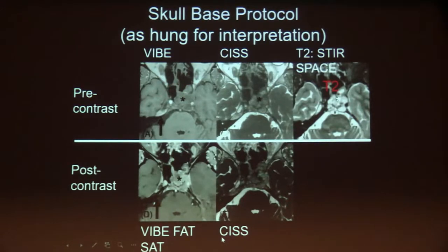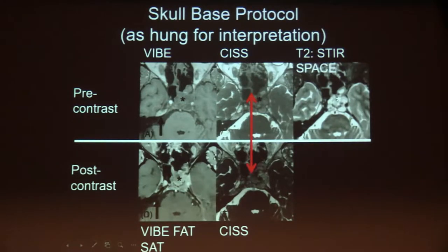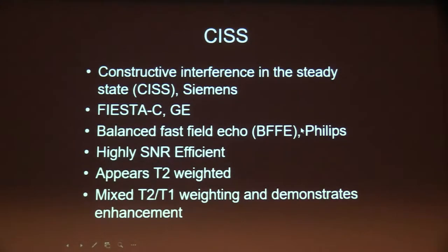We get our T2 appearance from the STIR SPACE imaging and enhancement on the VIBE post-contrast. This example is a chordoma — T1 hypointense, T2 hyperintense, and enhancing. But the key sequence, the meat of the protocol, is the CISS imaging, comparing pre- and post-contrast.